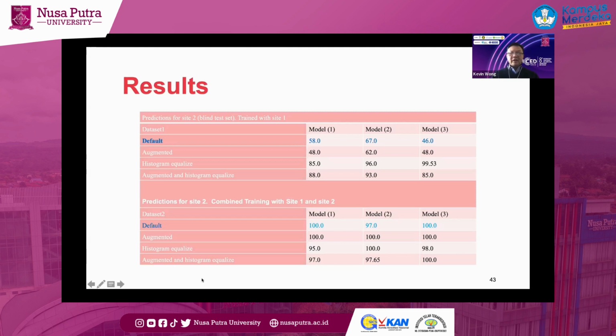The second one is you try to combine them. Then you realize that the accuracy is quite high. I know that the accuracy there is a little bit too high. I was quite shocked as well, but the reason behind it is because the blind test data they have is quite minimum. They keep quite minimum, and apparently a lot of them has been used in the training, so it's quite similar features to the training. That's why the accuracy is definitely quite high.